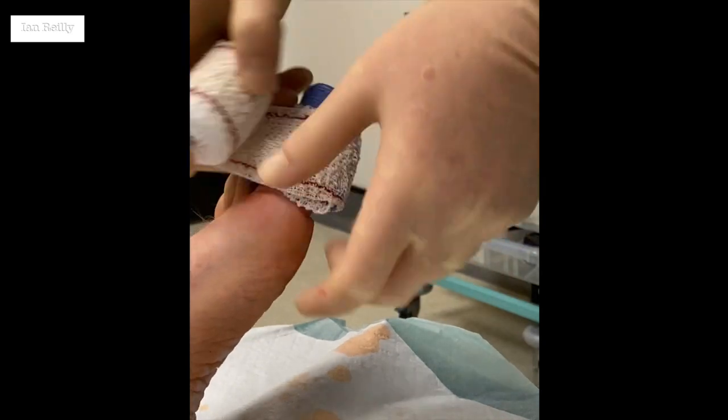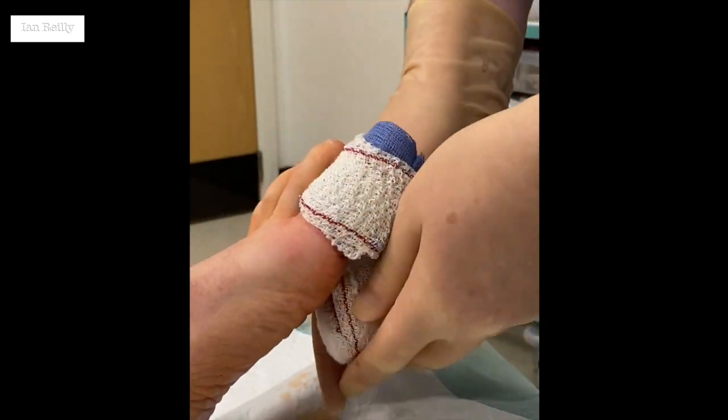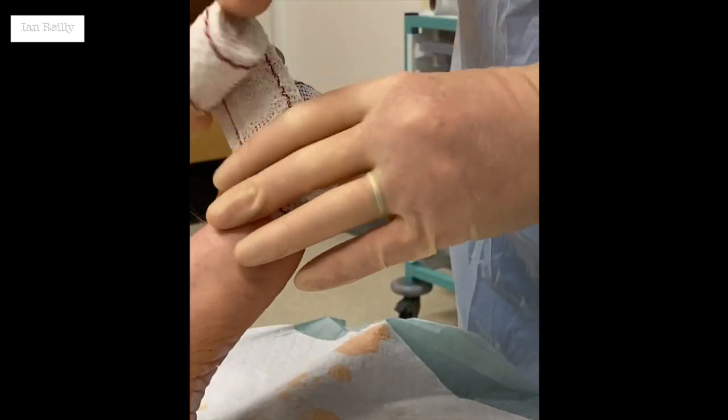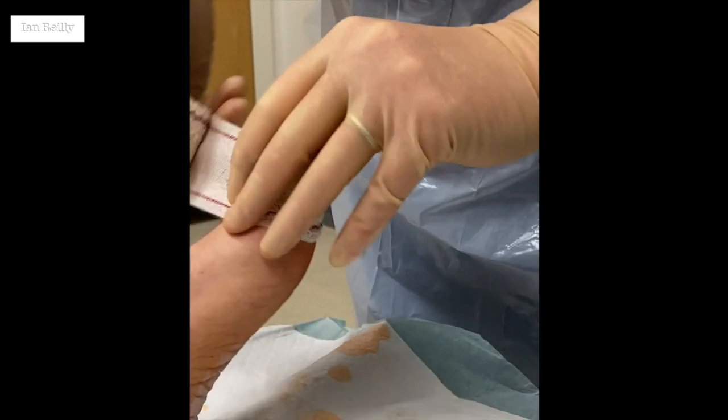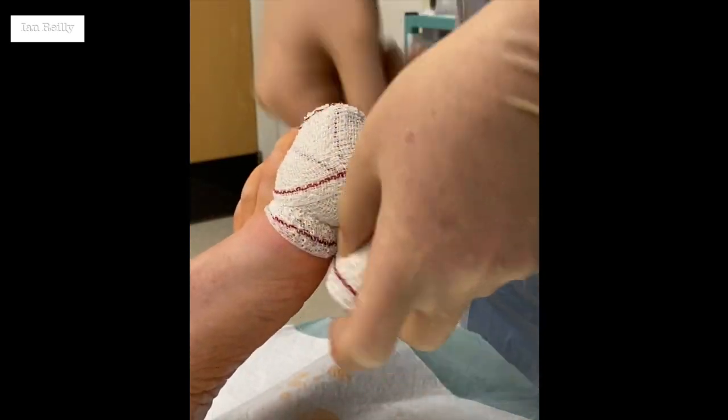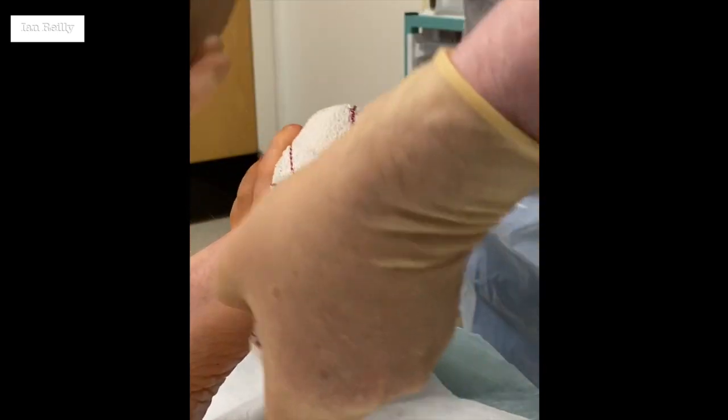So quite a bit down there actually, Andrew — that was really quite a bit bigger than I was expecting. But it's a nice one to do this technique for, because as opposed to just trying to phenolise again, it means I can physically cut everything out that looks a little bit suspicious.